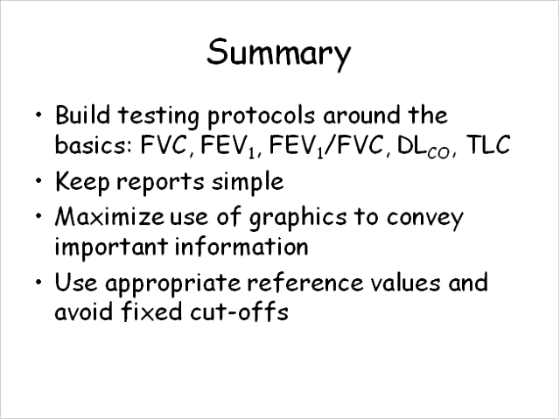So again, I think in terms of spirometry, in coaching the patient, it's very important to look at the patient and try to monitor as best you can that breath that occurs right before the maximal forced exhalation. Patients that do variable measurements many times do that because they don't really get a big breath in to start with. The thing that I most often end up coaching patients when I do testing is, okay, let's do that test again, but this time I want you to take even a bigger breath in. After repeating that several times, many times the patient's vital capacity increases, and as a result of that, the FEV1 gets better as well. So in terms of spirometry, I think that's probably one of the key things to keep in mind.